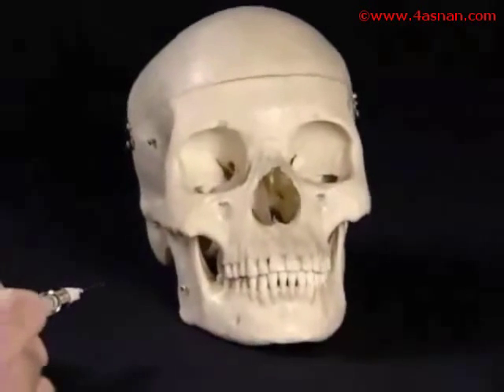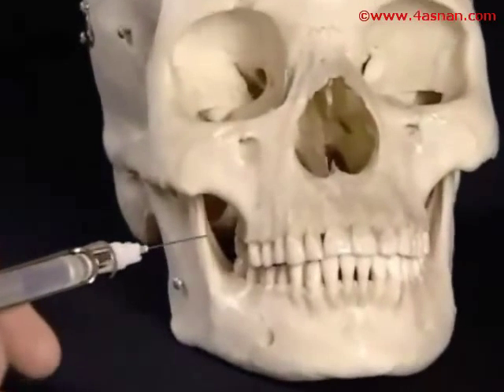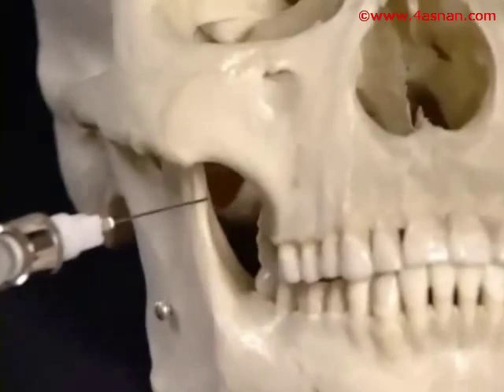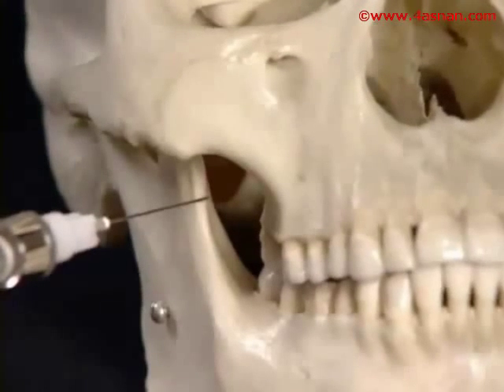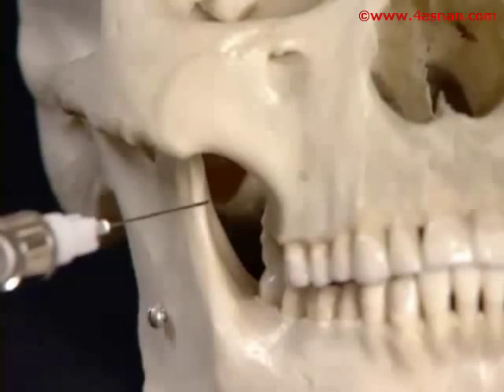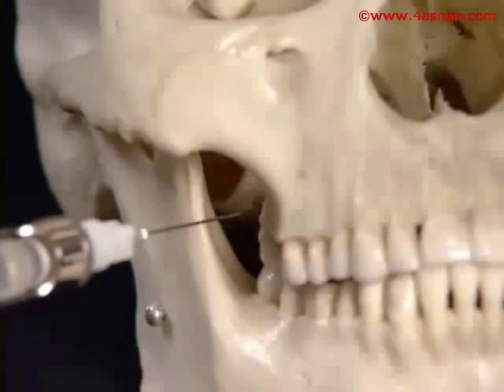It's important to begin by knowing where the anterior border of the ramus is. That should be palpated, and then the coronoid process noted. The coronoid process marks the lateral border of where you would want to insert the needle. The needle insertion goes between the coronoid process on the lateral and the maxillary tuberosity on the medial, and the point should be selected in between those two sites.